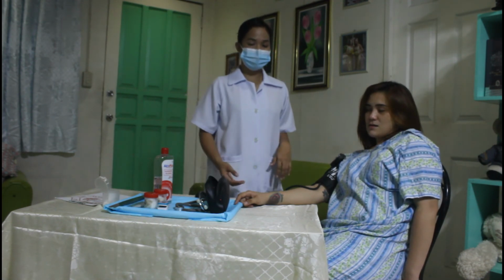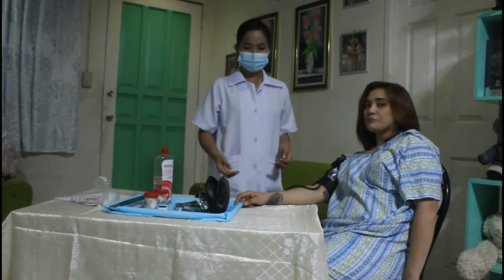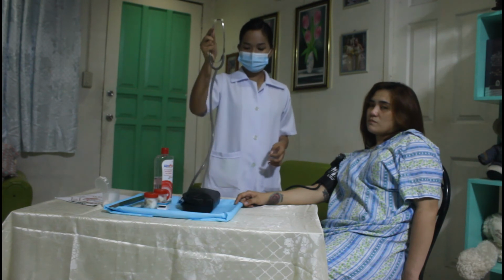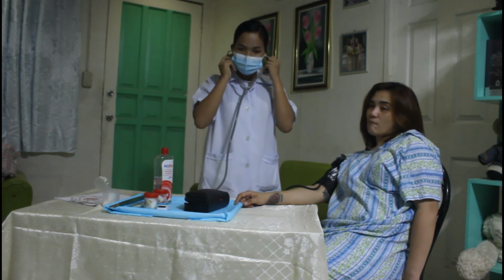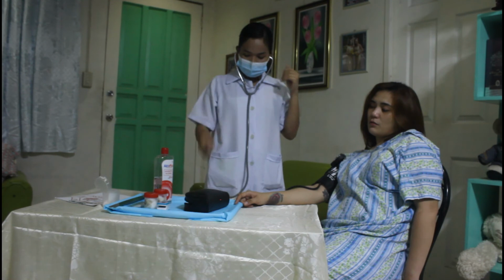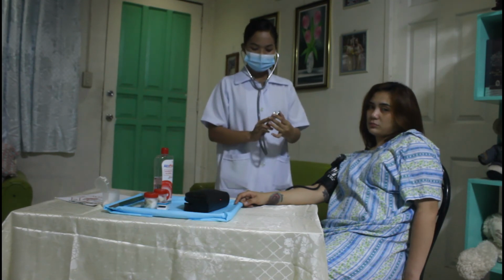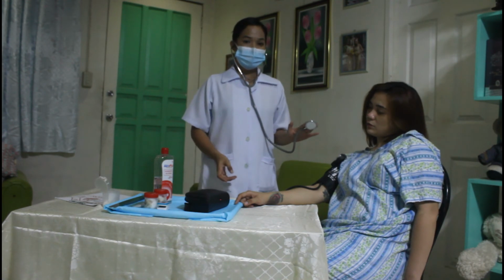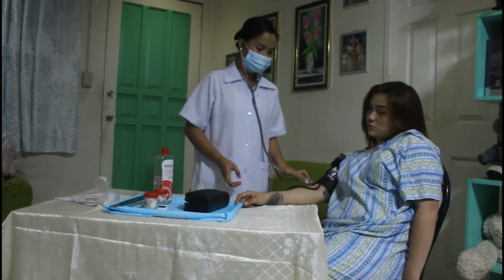Then we measure the pressure by placing the stethoscope, so we ensure that the sounds are clear and not muffled.